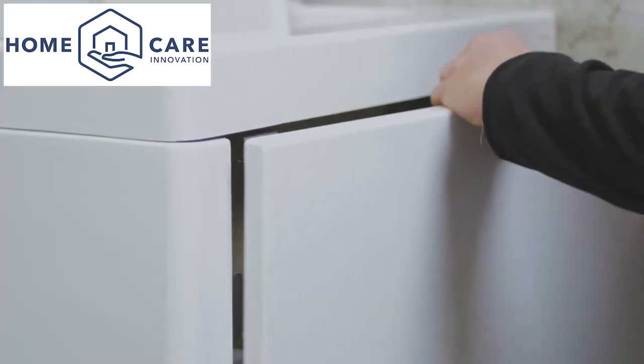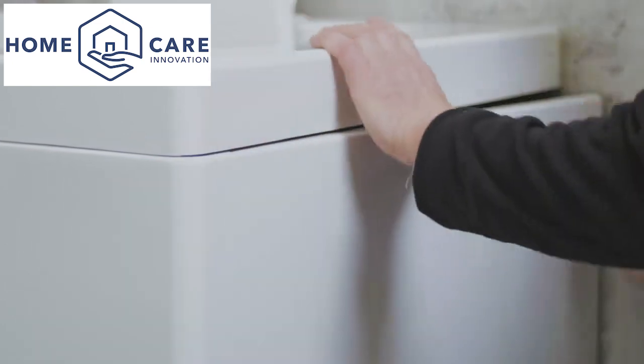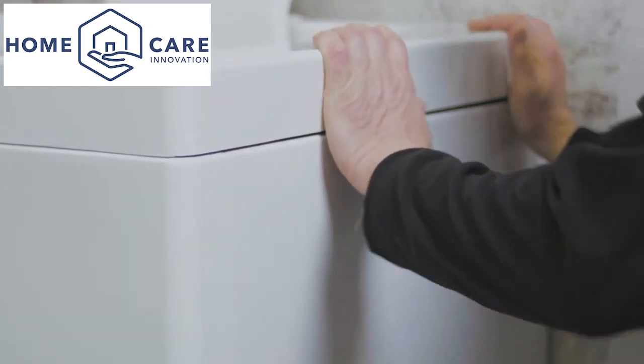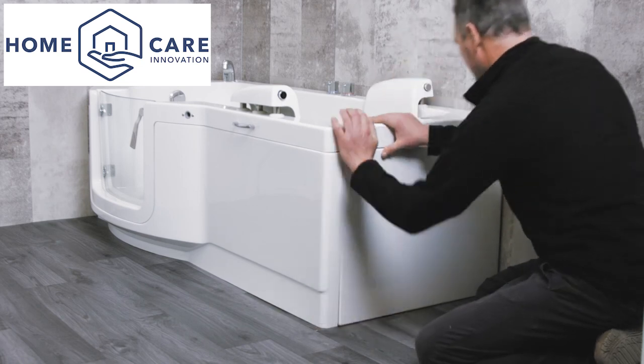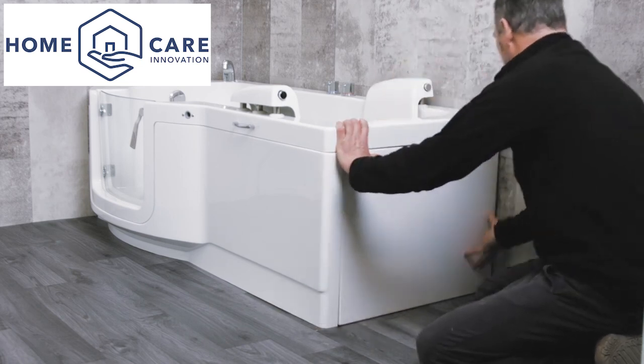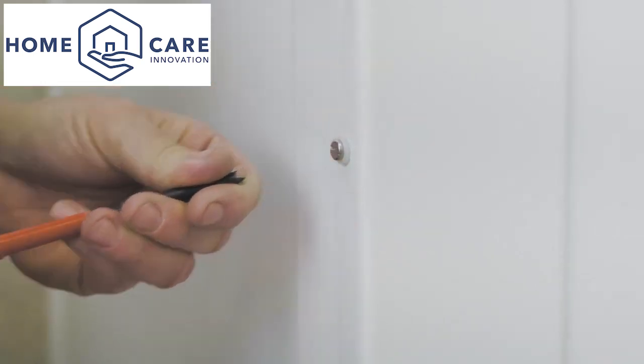Offer the panel up and secure it into place by firmly pressing at the top so that it engages with the panel clips. Use cosmetic screws and cap covers to fix the panels to the battens.